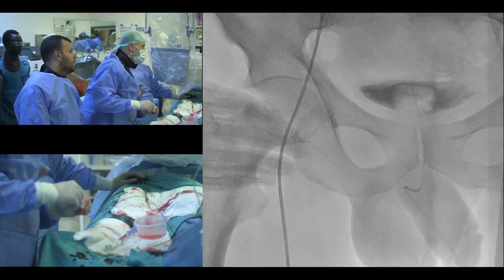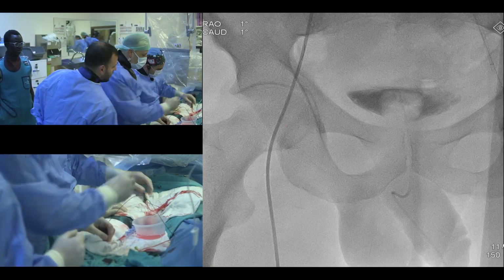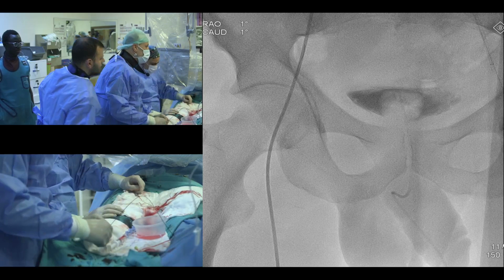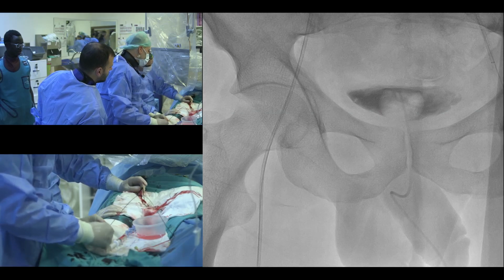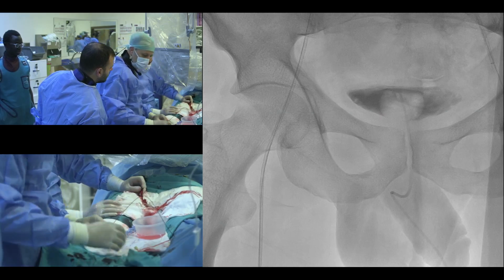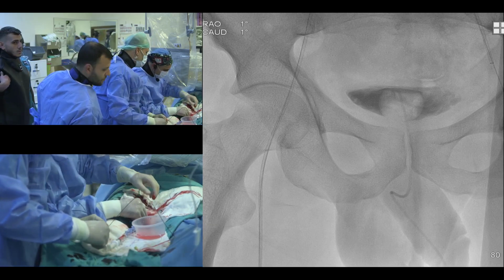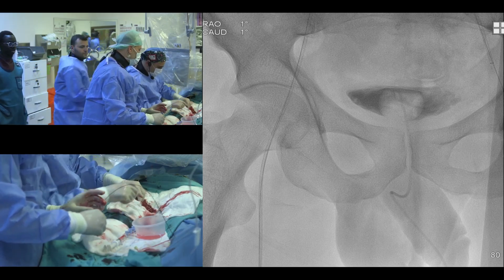Bir tane bekle. Alt sağ guiding ver bize şimdi. Ha yok, verme. Alt sağ guiding gerek yok. Tamam, verme. Sen gönder, çıkarırız buradan. Gönder. Gerek yok, çıkar. Bir tane şey alalım sadece. Biraz daha gönder. Tamam, okey. Tamam, harika.